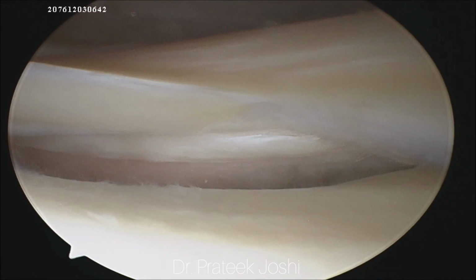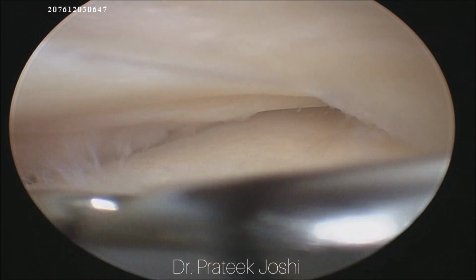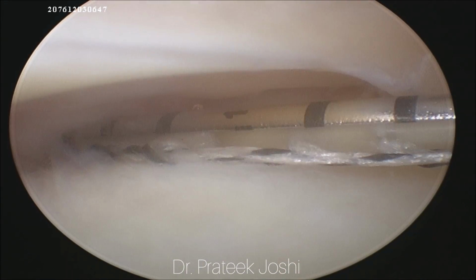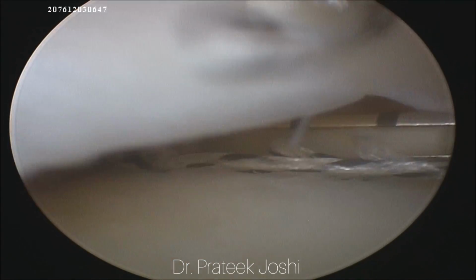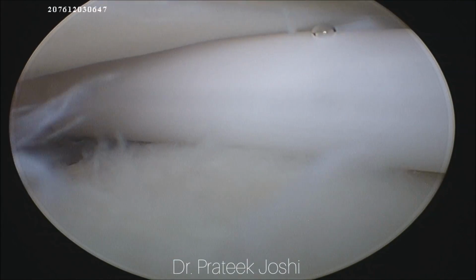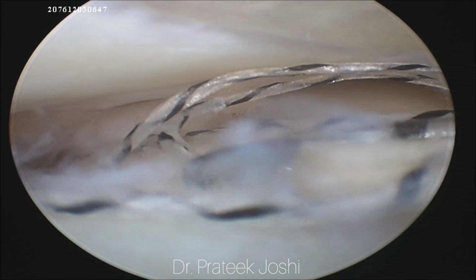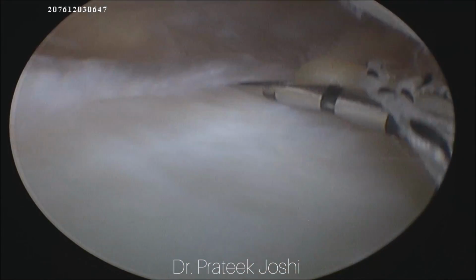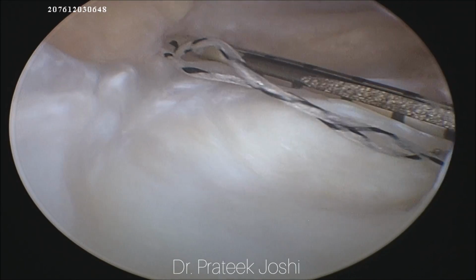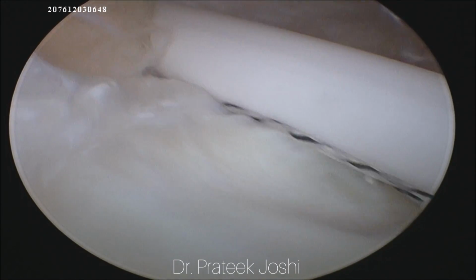So now I am going to change my viewing portal from anterolateral to anteromedial portal, and then I am going to introduce a sleeve on which I am going to introduce my all inside meniscus repair device. And as you can see, I am piercing the inferior capsule of the posterior horn of the lateral meniscus, and as you can see, I have deployed one implant inferiorly, and now I am targeting the superior capsule.